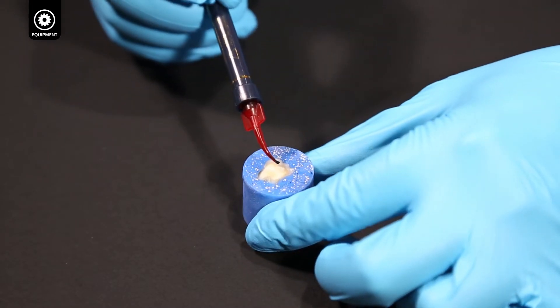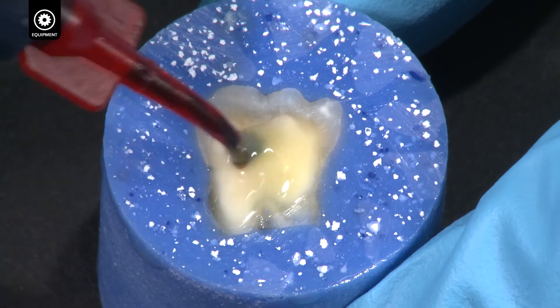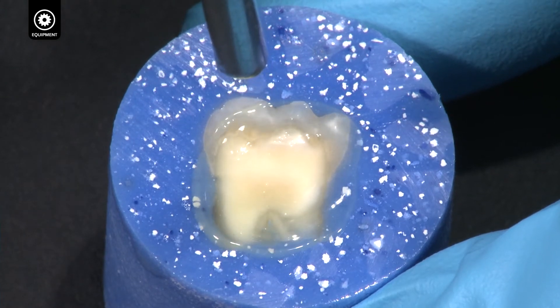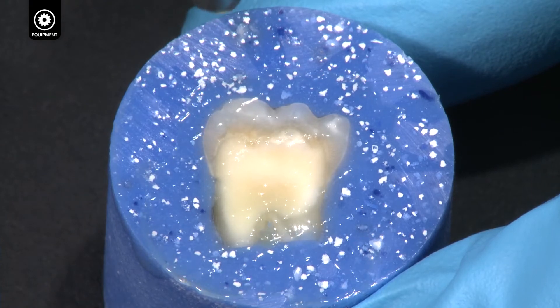Apply a complete puddled coat of Peak Universal Bond, agitating into the dentin for 15 seconds. Thin the adhesive with half air pressure at one centimeter for 10 seconds, until it looks like there is a thin, uniform layer of saran wrap over the surface.